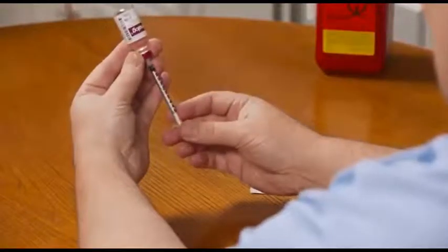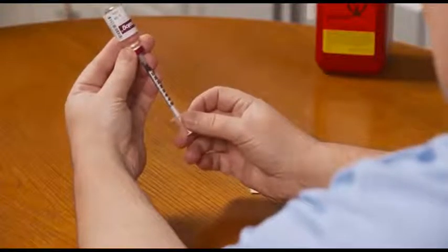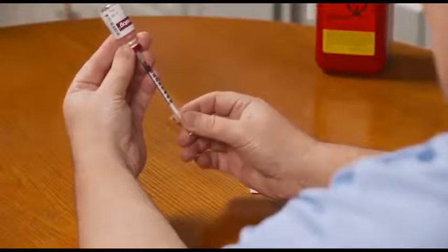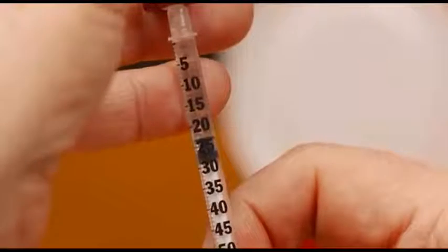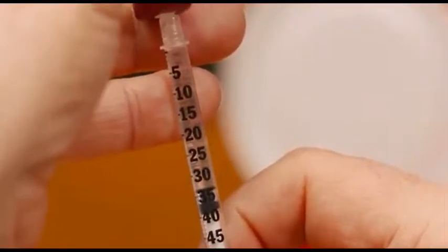To draw insulin into the syringe, slowly and steadily pull down on the plunger until the end of the black rubber stopper closest to the needle is even with the line on the syringe indicating your dose. In this case, 34 units. It's important to pull slowly, since pulling too fast will create tiny air bubbles in the syringe. These air bubbles take the place of your insulin, which keeps you from getting your full dose.